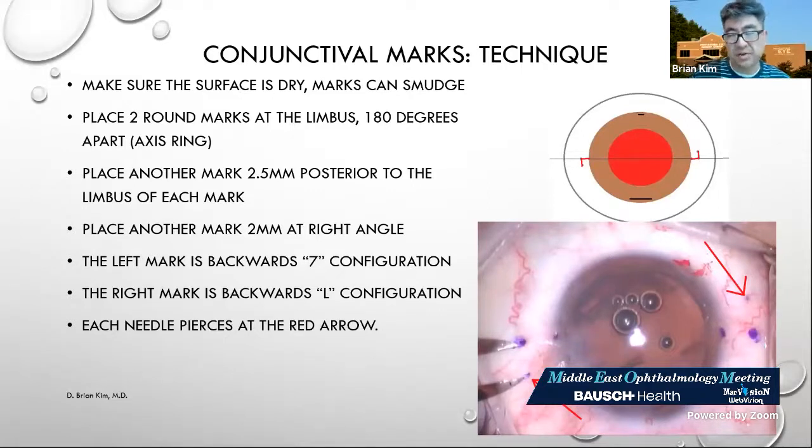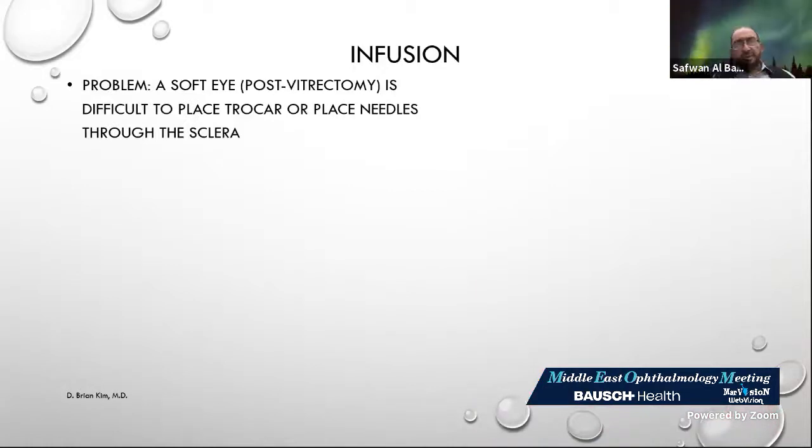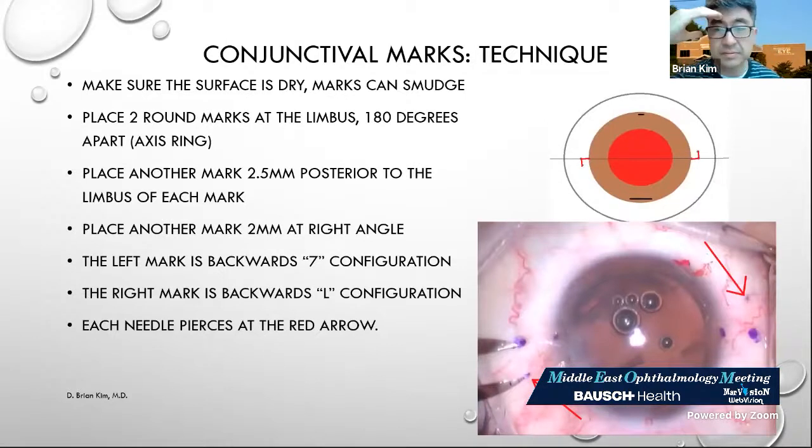Brian, just one point to comment here: you made 2 paracenteses, just for the audience. The standard Yamane is 1 paracentesis. Your modification is to create another paracentesis at 6 o'clock, and that's an important point, because some of the audience, like me, are using it so I know, but others are beginners. They don't know that the second paracentesis is your modification.